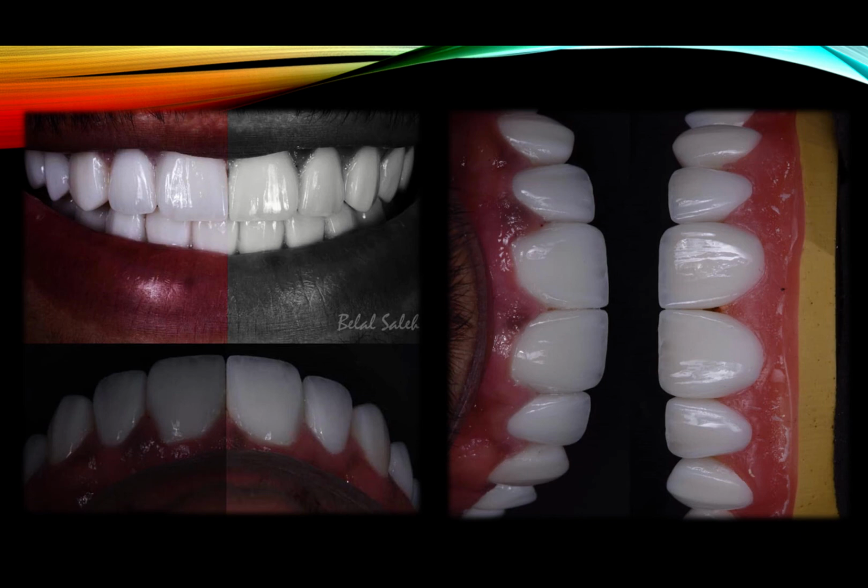you can use a little bit of stains, especially actually on bleach. You rarely get to use any stains anyway. But I'm saying you can give it opacity by stains, or if you find that it's low translucency, it's good masking. It's not medium translucency or high translucency. It's low translucency. It does a good masking actually.